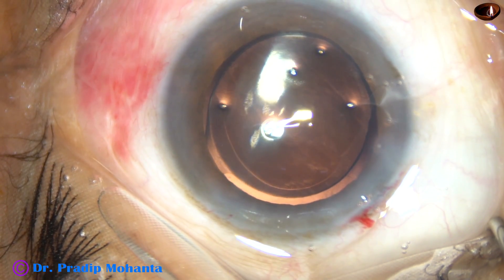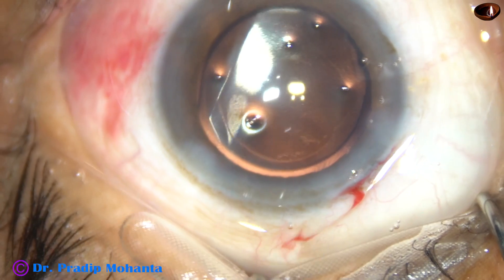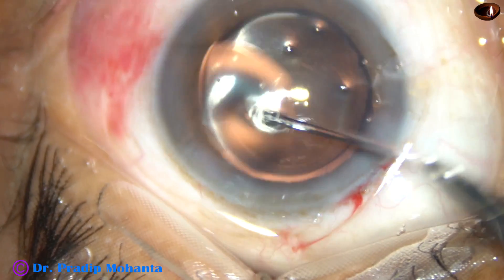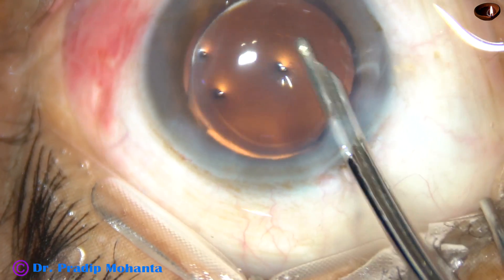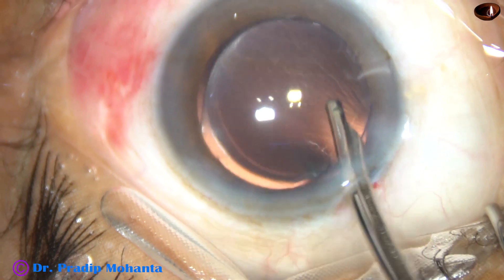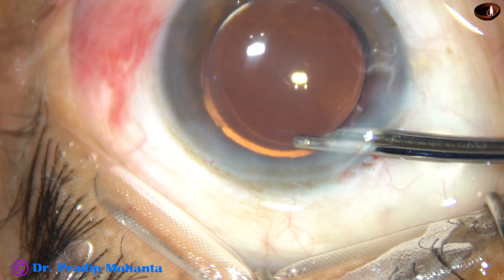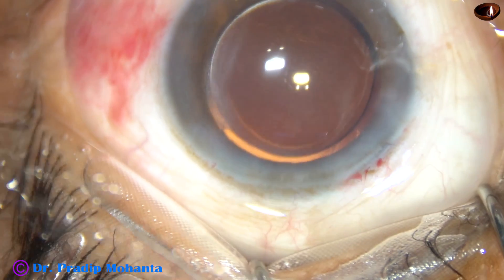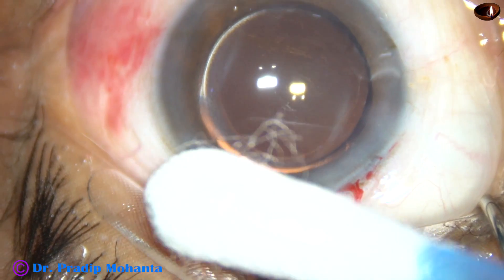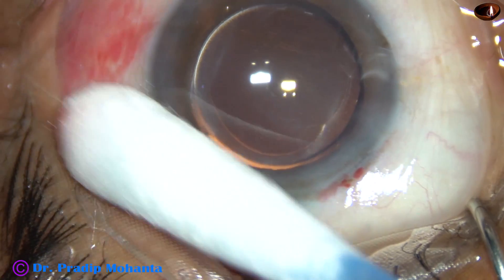A bit of moxifloxacin is applied. The side port is being closed by hydration of the corneal stroma on either side of the stab wound. This is the final lavage of the anterior chamber. The optic is nicely covered all around by the rhexis margin — the rhexis size is about 5.5 mm, which is ideal. The anterior chamber has been formed nicely and the integrity of the wound is checked with a cotton-tipped Johnson bar. A few drops of moxifloxacin are applied over the ocular surface and the case is concluded.